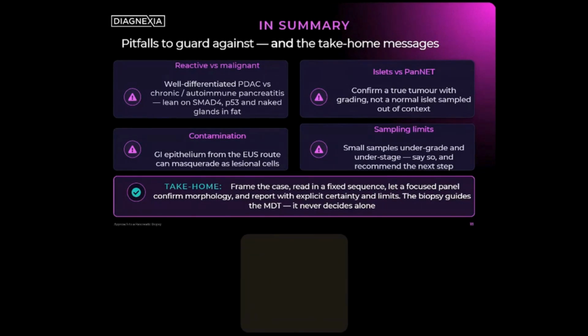Remember about contamination of epithelium from other sites. And very importantly, if you've got small samples, just recognize the limitations that the small sample provides, that you cannot overcommit, and stay within the limits of your discretion.